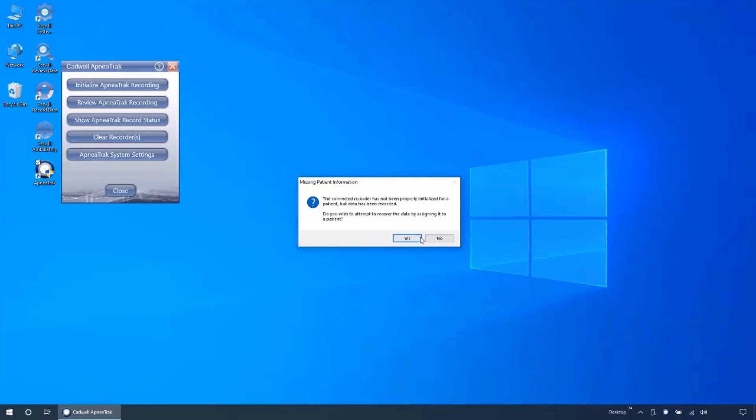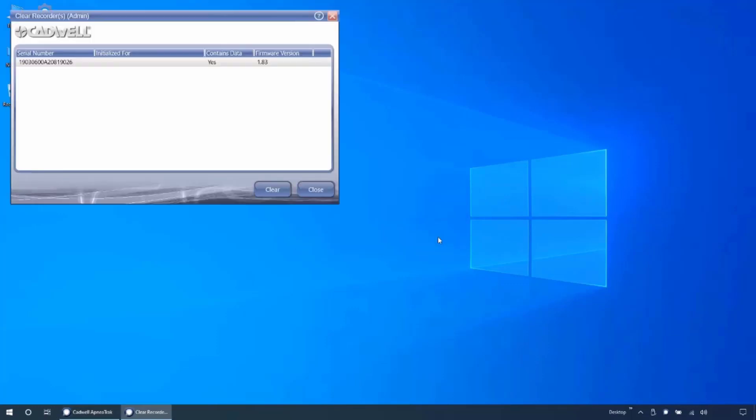If you click no when connecting a device without patient information, you will be taken to the clear recorder menu so that you may manually clear the device.